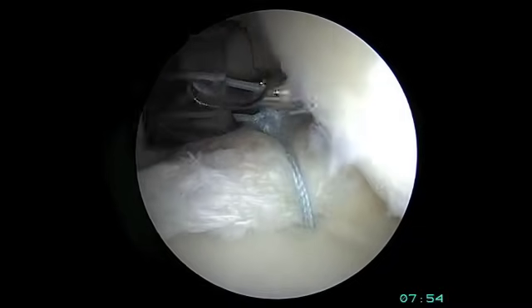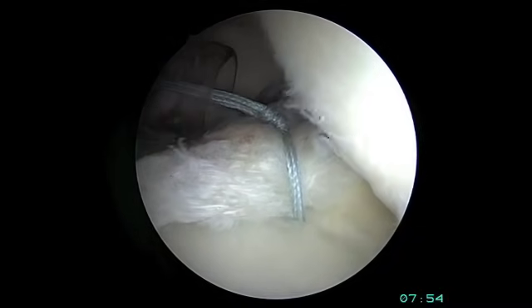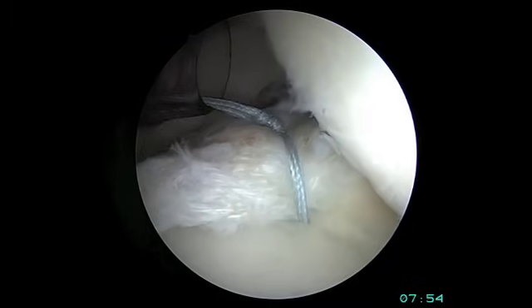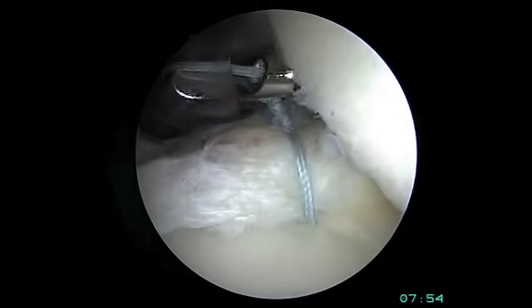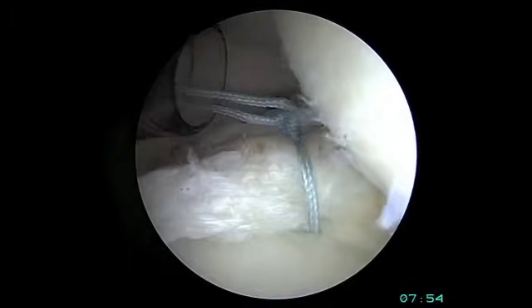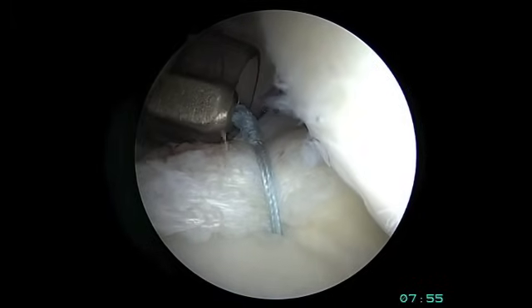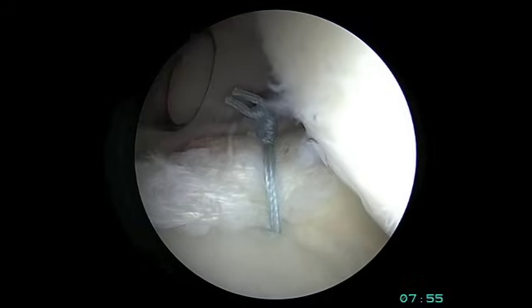We then back up this locking sliding knot with three alternating half hitches on the shoulder joint. The suture tails are then cut precisely with an arthroscopic suture cutting device.